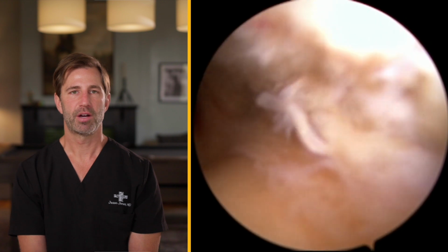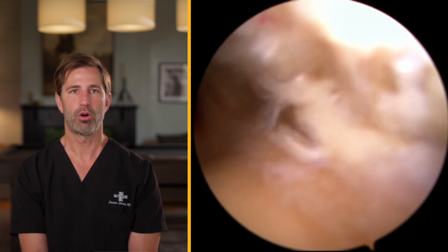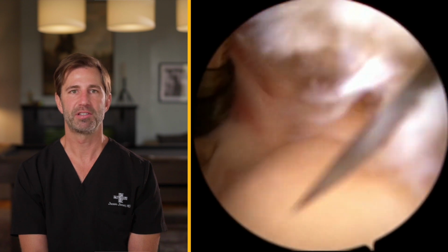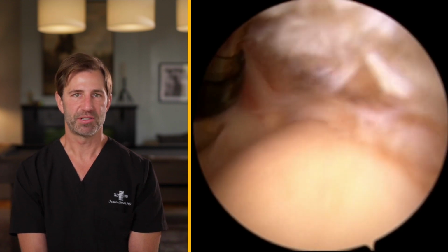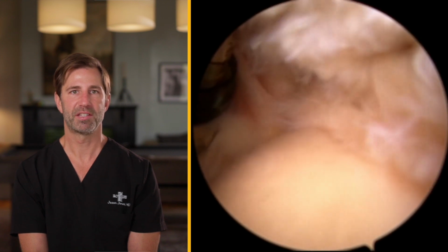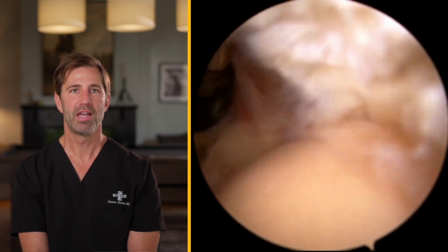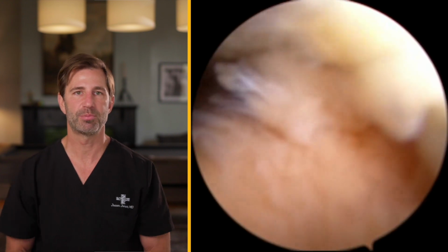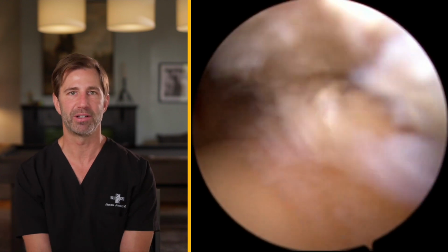Now we're looking at the rotator cuff attachment itself. This patient has a large rotator cuff tear. There are some residual fibers present, as you can see. We'll take these fibers down to complete the rotator cuff tear in full, because this allows for us to more fully take the healthy tissue and pull this over to the patient's normal rotator cuff attachment, which is referred to as the footprint.